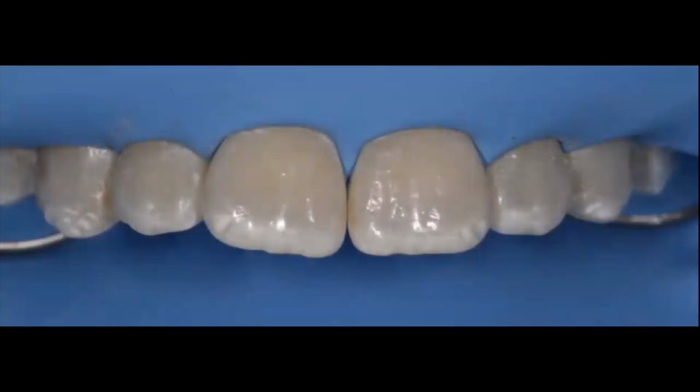And here it is. Once you place a rubber dam and the teeth dehydrate, you can see how noticeable these white spots due to fluorosis now become. And this is the reason why we wanted to make sure that the patient understood that we could treat this or we could leave them the way they were. But if we left them, we needed to make sure that in our restorations on the mandibular incisors, we added some of this characterization just to make everything blend in well. But the patient did not want to have these white spots once he was made aware of them. And once he saw them on these photos with rubber dam isolation, because of dehydration, they really show up much more.